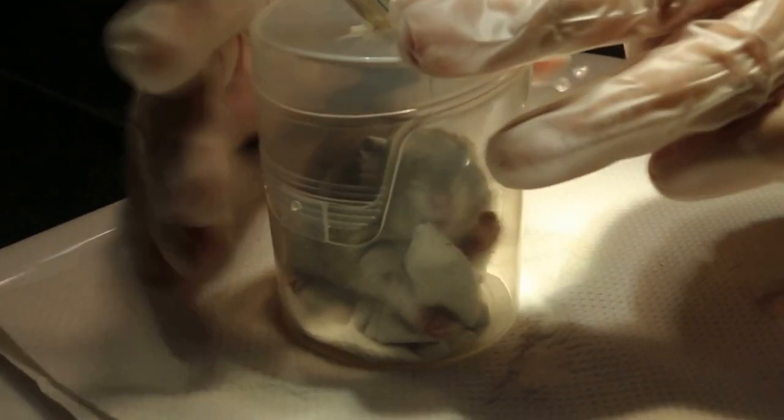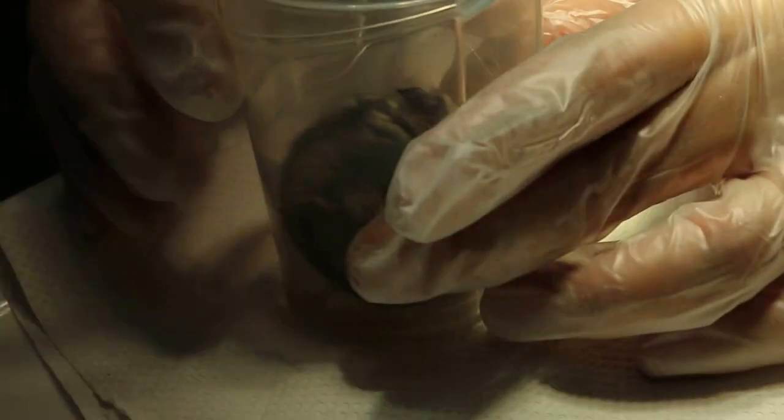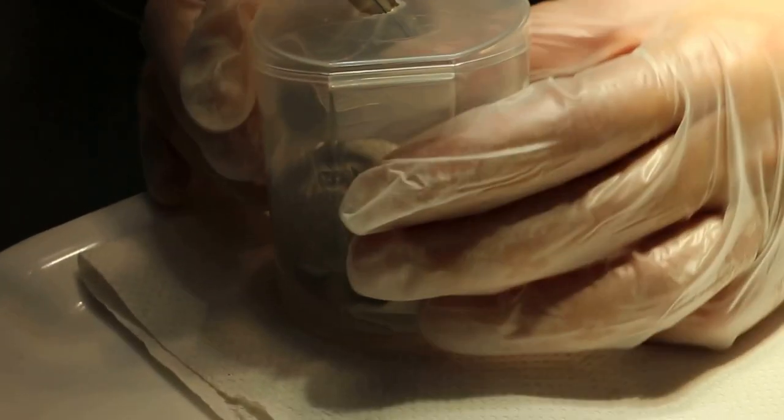on the left forepaw, D2 and D3, show here, it's a D2 and D3. The left forepaw, this must be illustrated in the case history, so that we know what we are doing. And the time we put down there, 11:43 a.m., the guess. Okay, so now you see, this hamster is going to go down already soon. So once it's down, when he's not moving, then I'll take him out and use electro-surgery.